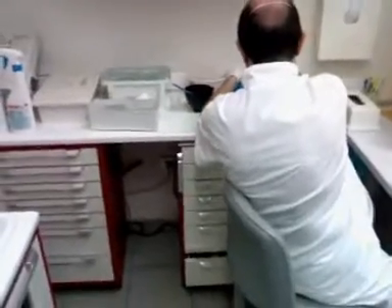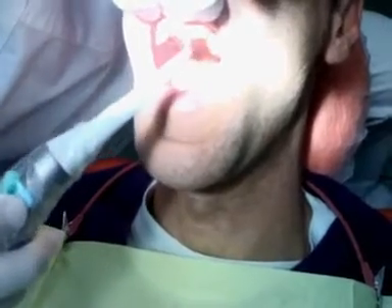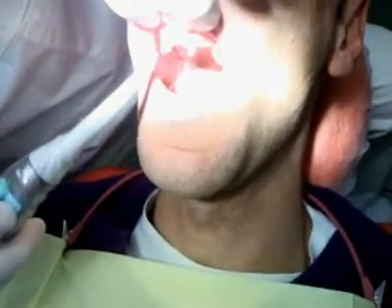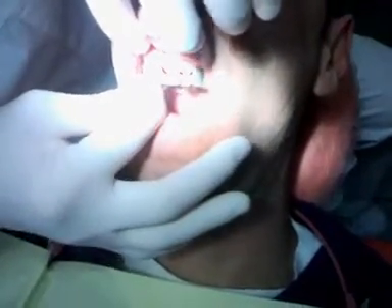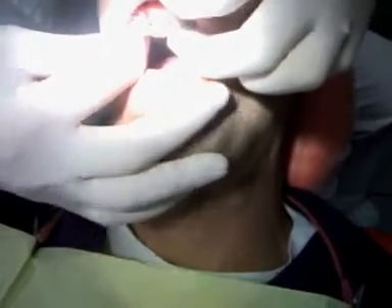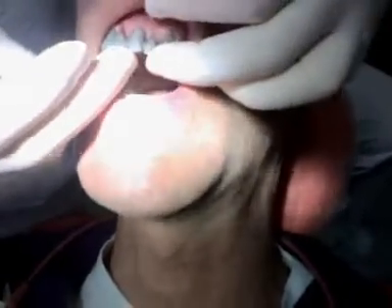With the doctor now, he's going to be trying the case in the patient's mouth and he has pulled it out. We're going to see here what it's going to look like. The patient is young and his temporaries are out. Here's the framework — it feels nice and tight in the mouth the way it's fitting in.